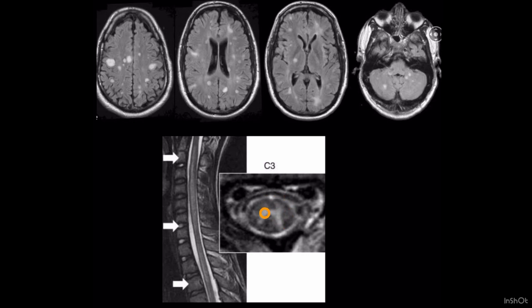Only white matter is involved. As you can appreciate, this H-shape structure is the gray matter, and you can clearly see the shape of the H. This shows there is sparing of the gray matter of the spinal cord but involvement of the white matter of the spinal cord.